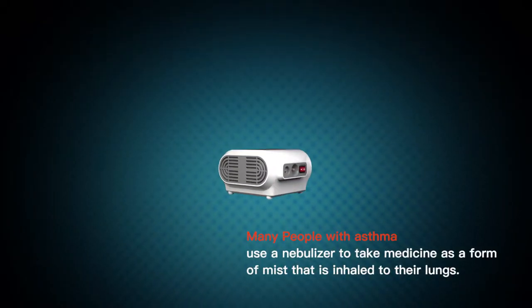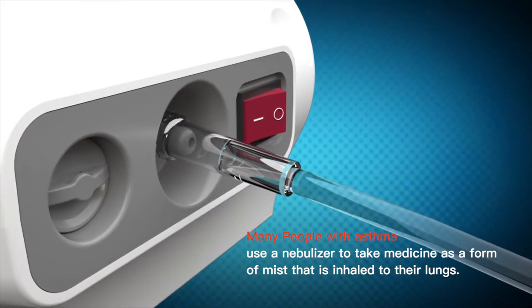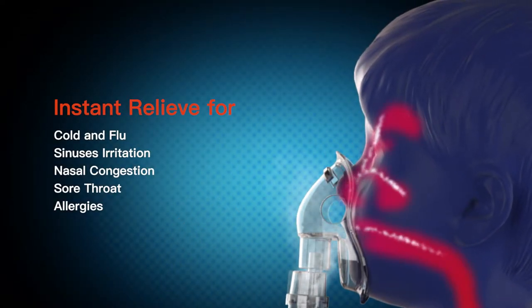Many people with asthma use a nebulizer to take medicine as a form of mist that is inhaled into their lungs. It provides instant relief for cold and flu, sinus irritation, nasal congestion, sore throat, and allergies.